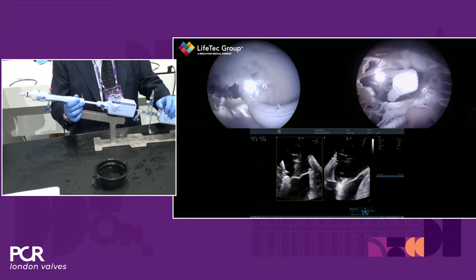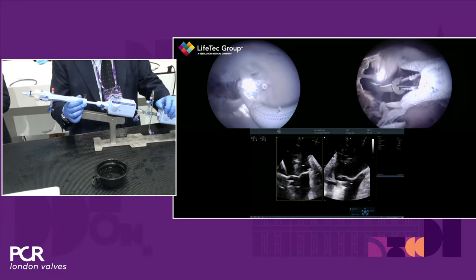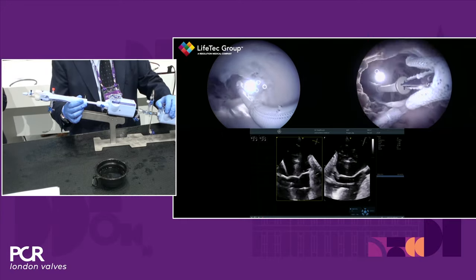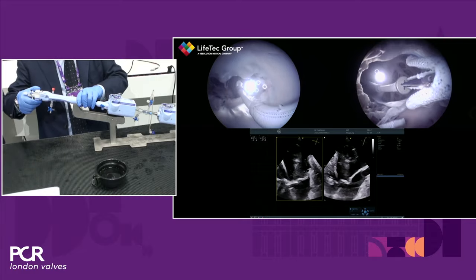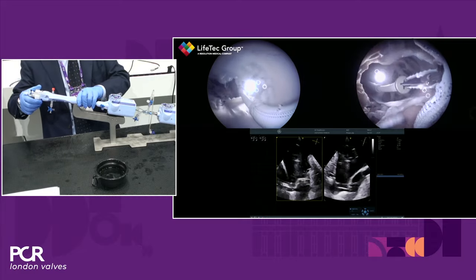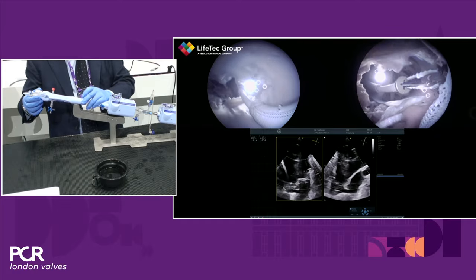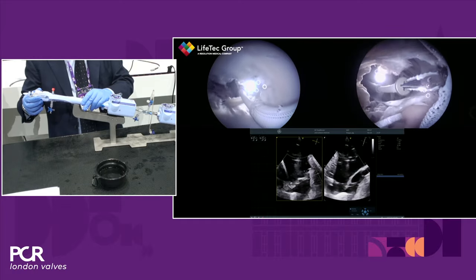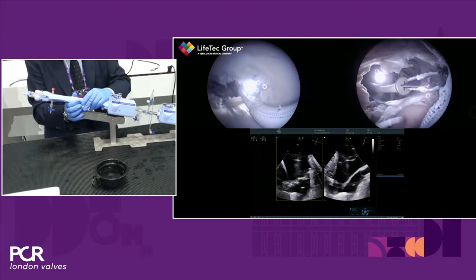In A2P2, there is no chordal density below, so you can eventually also consider to advance the clip without completely closing it. What is important is not to lose the clocking. So we check the clocking and the perpendicularity of the clip arms in the left atrium. We don't want to lose this while we cross. So it's extremely important to check it again before grasping the leaflet.